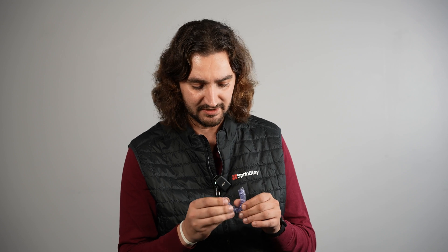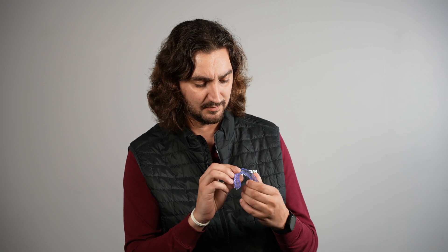Do you know why 3D printed night guards are better than milled night guards? Probably because they'd be cheaper. It looks like something that could be custom made for the patient very easily. You can print them a lot faster than you'd mill a night guard. If you have any issues with your night guard, you can easily go back into the program, redesign it very quickly, make any little adjustments to it, and print it.